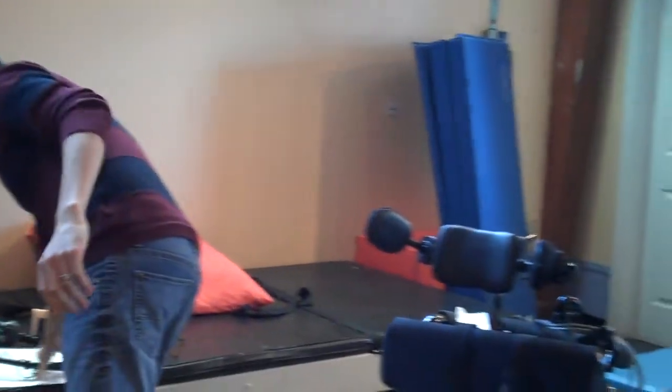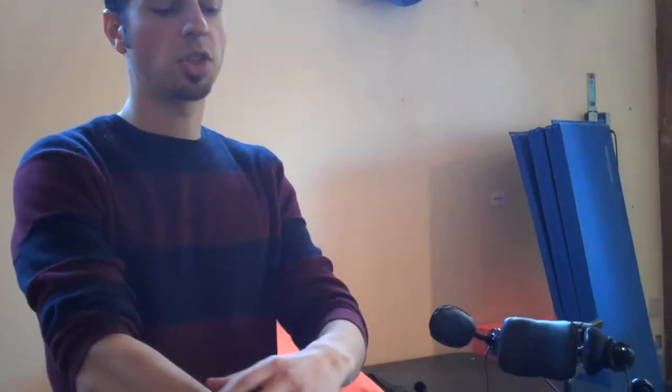But a head array is quite special because the head generally is a pretty stable part of the body. So you're not dealing with the long kinematic chain of what ends up distally at the end of the hand. And it's very intuitive in that if I want to go to the right, I look to the right, and that switch is there, and you activate that switch.